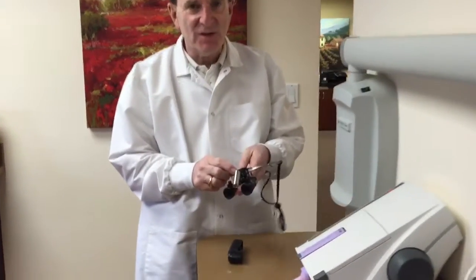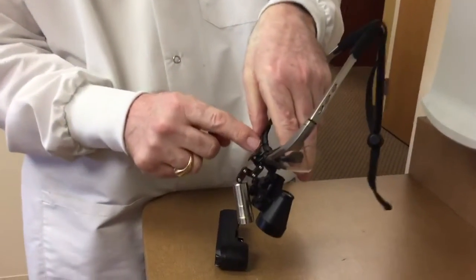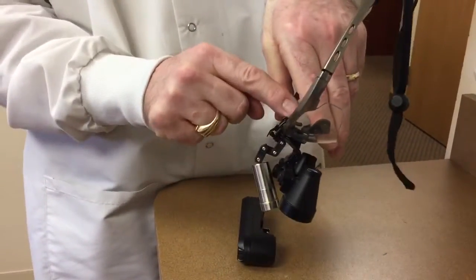As you can see here, I've attached the light to my magnification loupes with our universal attachment. It just slips on right over the loupes.